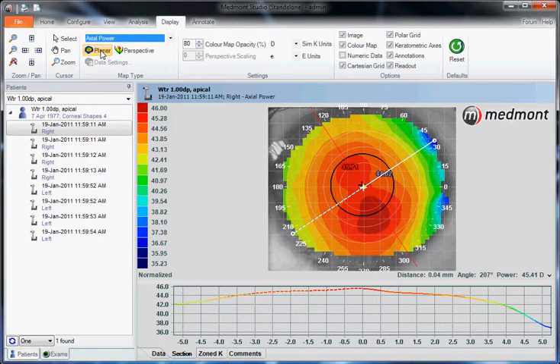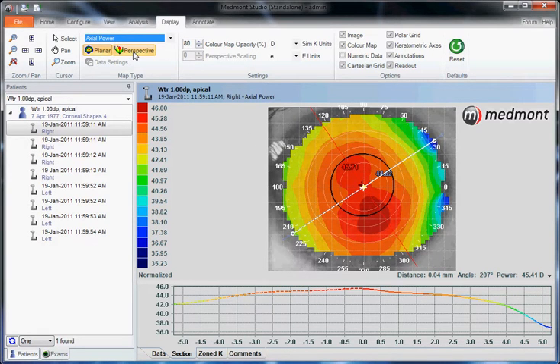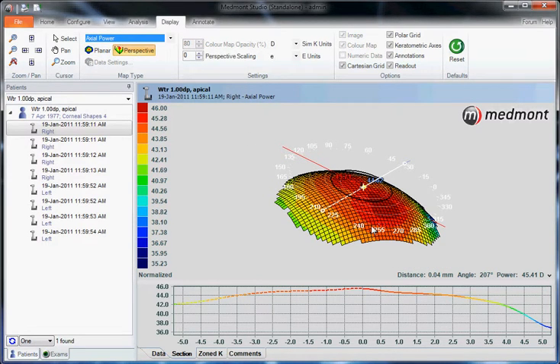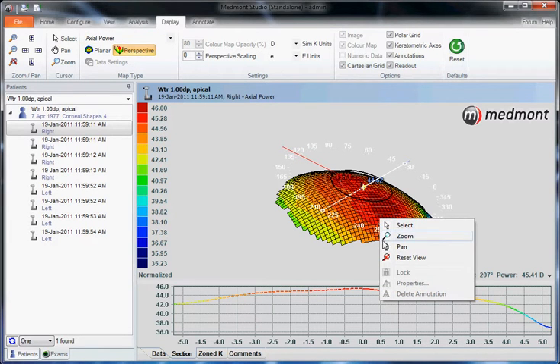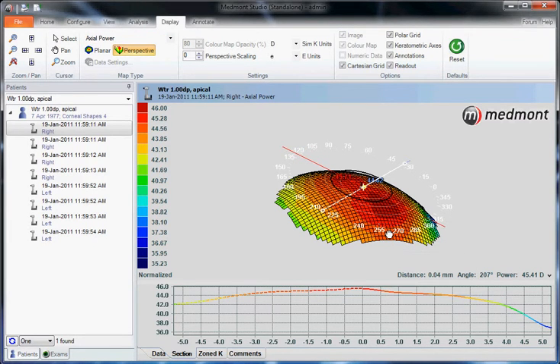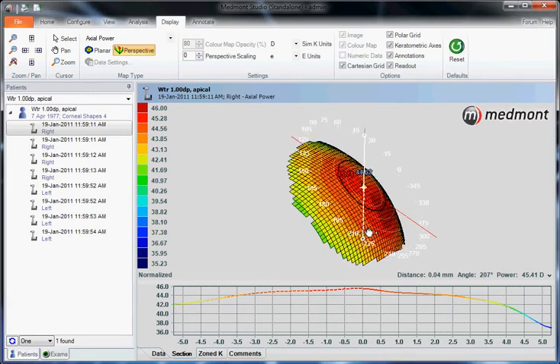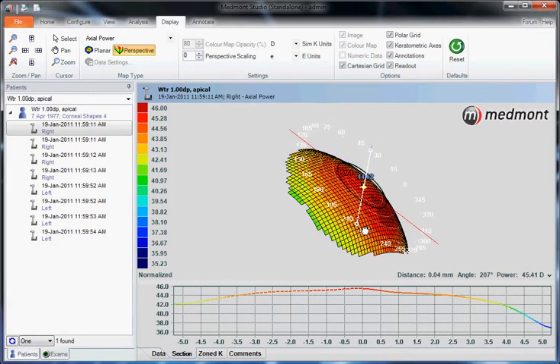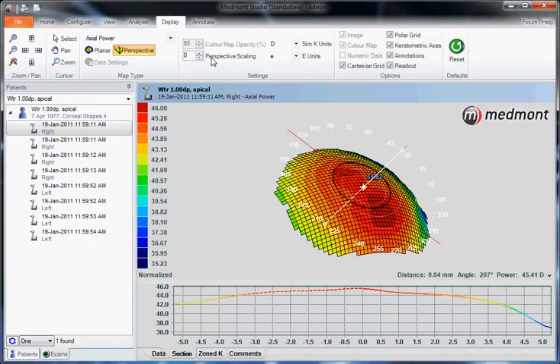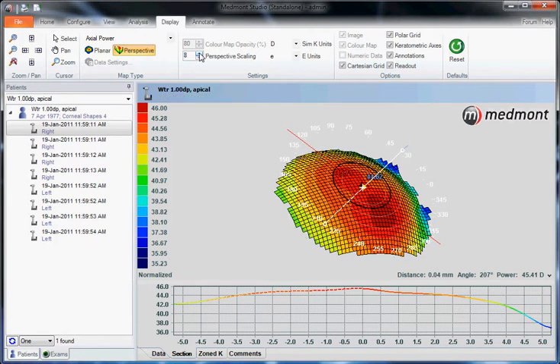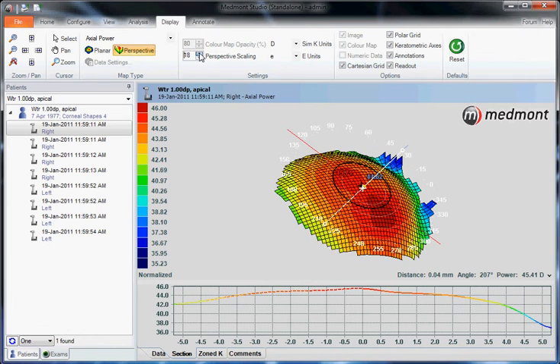The standard view is the planar or two-dimensional view, which gives us the top-down appearance of the topography. If we click on perspective, that gives us a 3D view. We could right-click, select pan, and click and drag the topography to give us the orientation we prefer. By increasing or decreasing the perspective scaling, that allows you to accentuate areas where the eye may be very curved or not so curved.